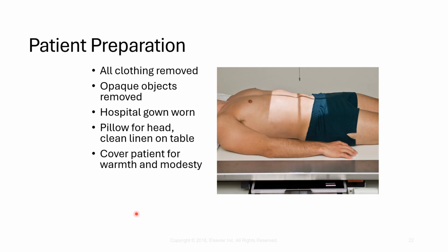As far as patient preparation, this is on page 110. With this exam in the abdomen, basically all clothing has to be removed. Typically that includes top, bottom, underwear. Shoes and socks I would usually leave on the patient until they come into the room, and once they get up on the table, then I would take their shoes and socks off, but prior to that I would leave them on so that they're not walking barefoot on the floor or stepping on anything.